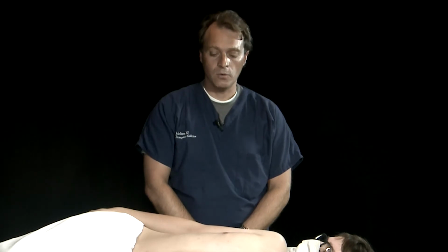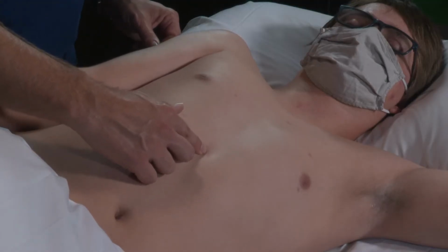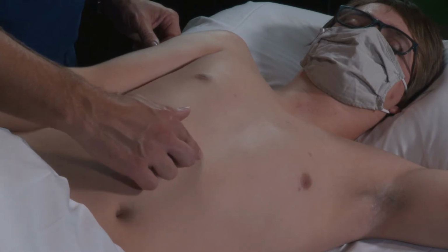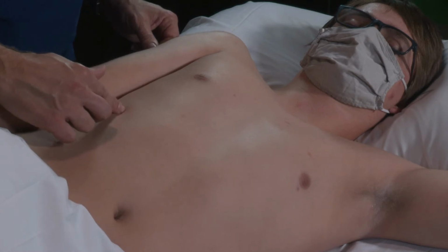For our subcostal windows, we're going to place the transducer immediately inferior to the xiphoid process. Again, the marker dot is going to be pointed towards the patient's right flank. The same orientation as our apical 4-chamber view.